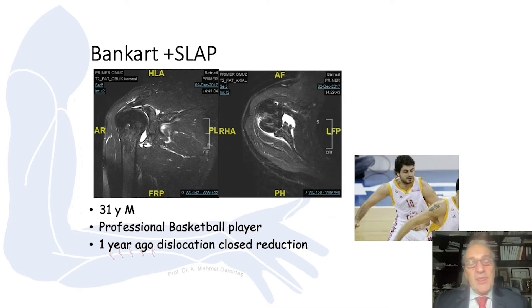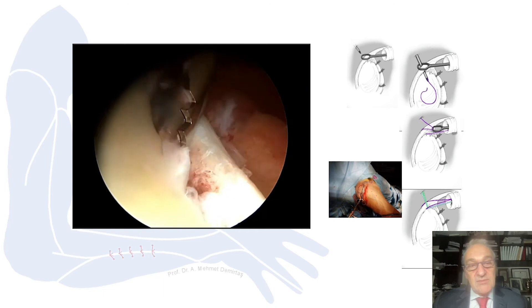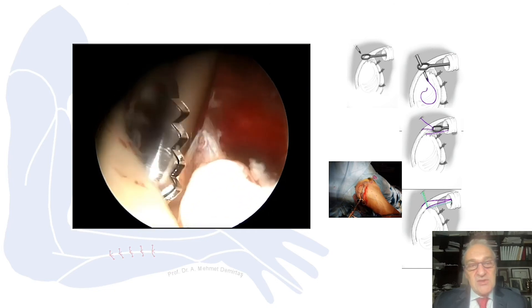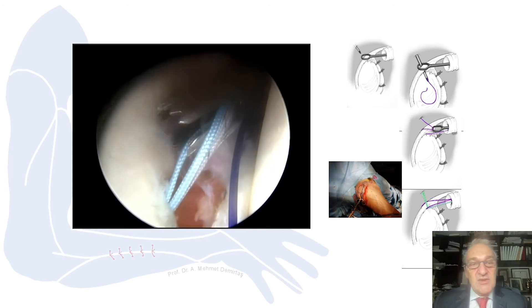Sometimes, especially if it's an athlete, the Bankart lesion is also accompanied by a SLAP lesion, because the biceps also contributes to shoulder stability. With high-energy trauma, a SLAP lesion may be present as well. If you pay attention to this video, different from the other case, you can see intact labral tissue.